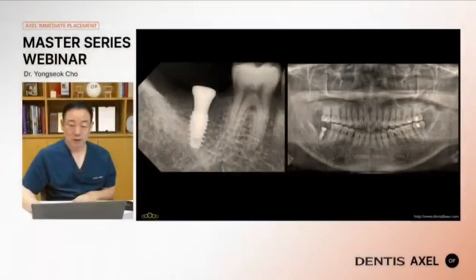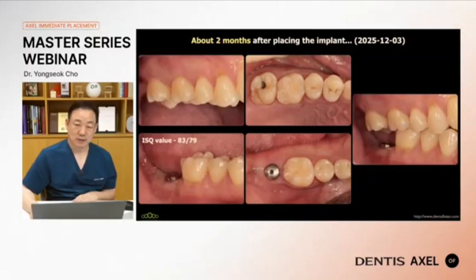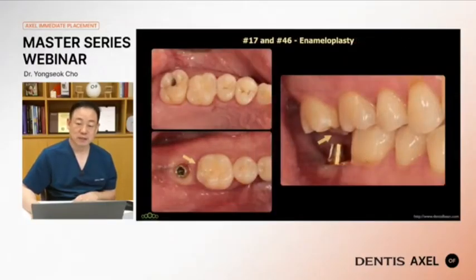Here are the postoperative radiograph images, a well-positioned implant, and 2 months after the healing, nice condition. So using a stock abutment, the final crown was fabricated.